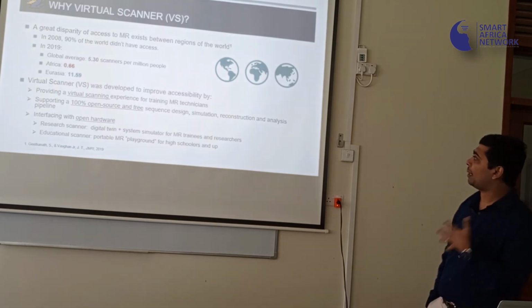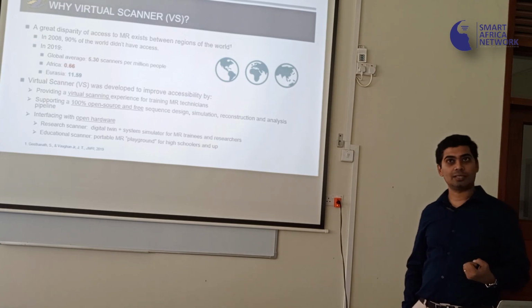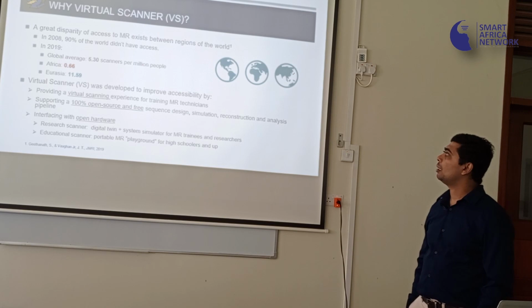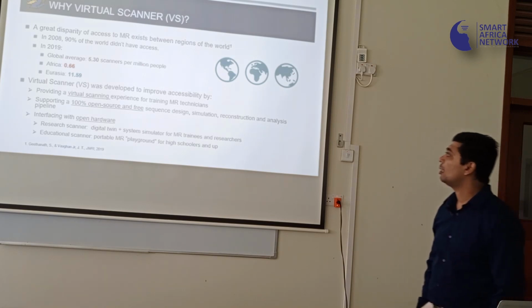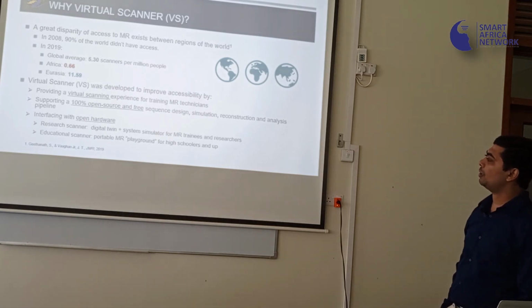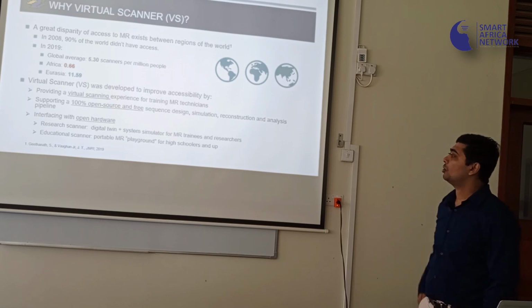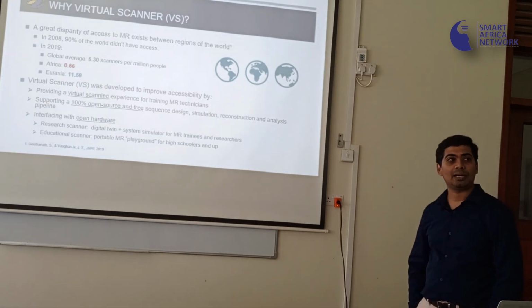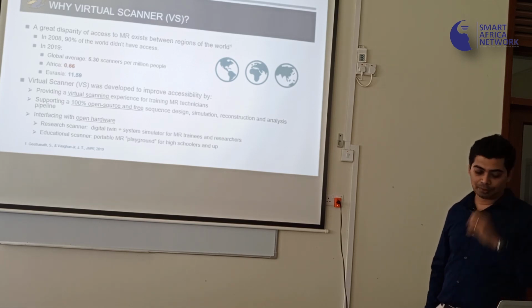So, just to give you background on why we got motivated with Jonas's challenge, the ISMRM Junior Fellow Challenge 2019, the accessibility to MR scanners, like you can see, is diverse across the globe, and specifically where we are today, the prevalence is low. So when you have a virtual scanner, you can actually start playing around and visualizing. All you need is essentially a laptop or some computing device.